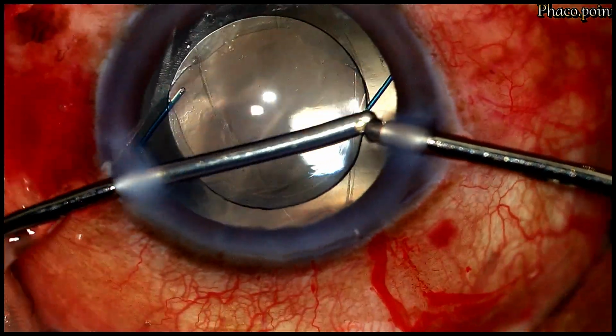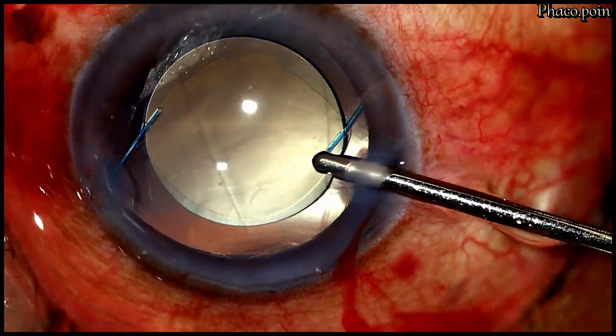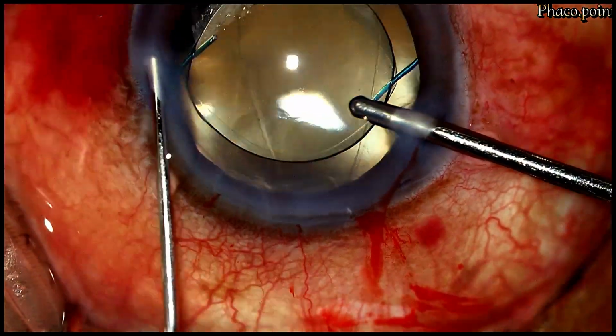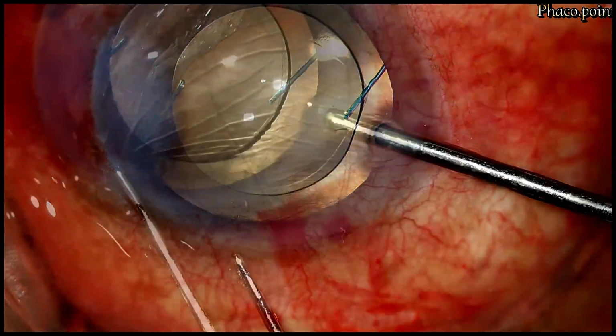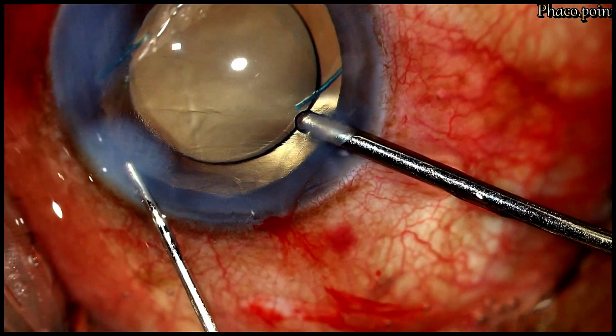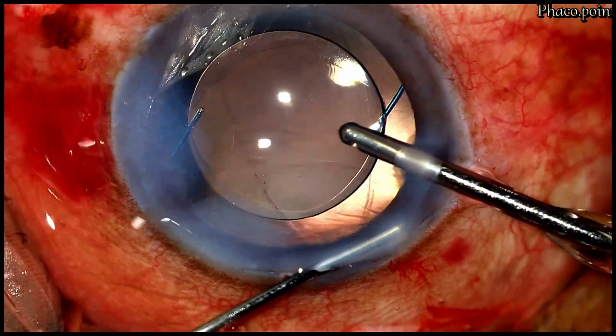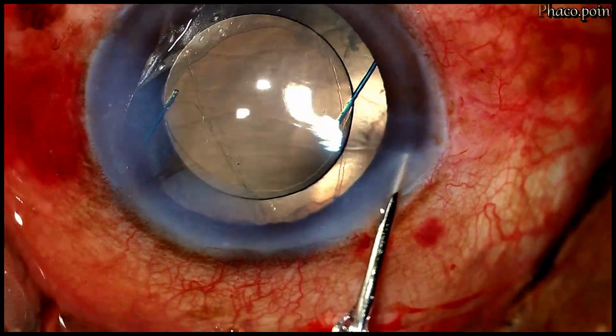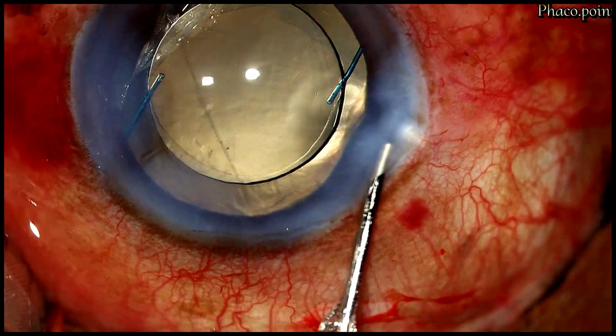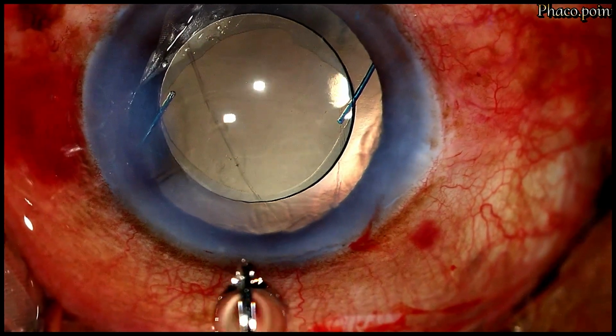Having completed the visco wash, while still maintaining the irrigation in the eye, the left paracentesis incision and the main incision are hydrated. And finally, the irrigation is removed from the eye and the right paracentesis incision is also hydrated.